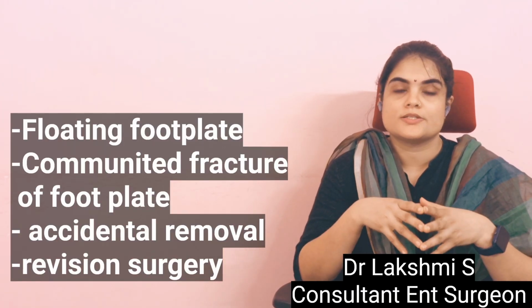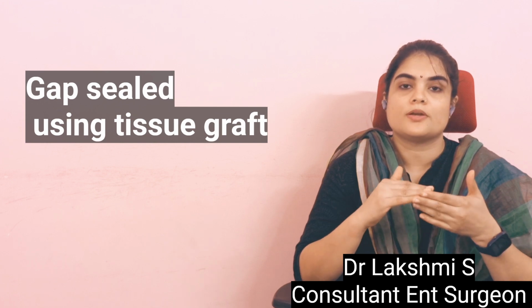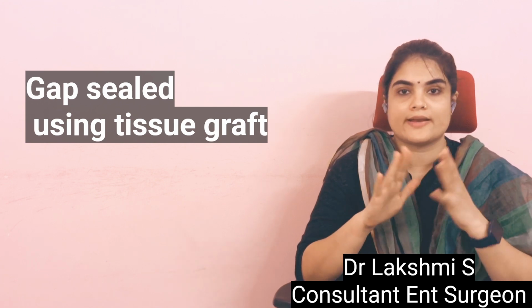In certain revision surgeries, you do stapedectomy. Stapedectomy also is done in the same way. The footplate is removed, and then you keep the piston, and the area around the piston is supported and closed using a fat or a graft.